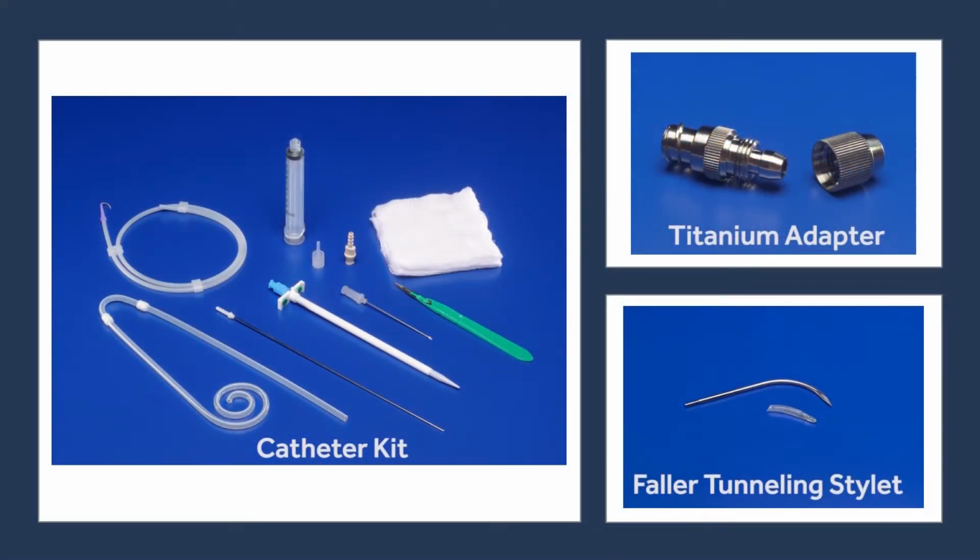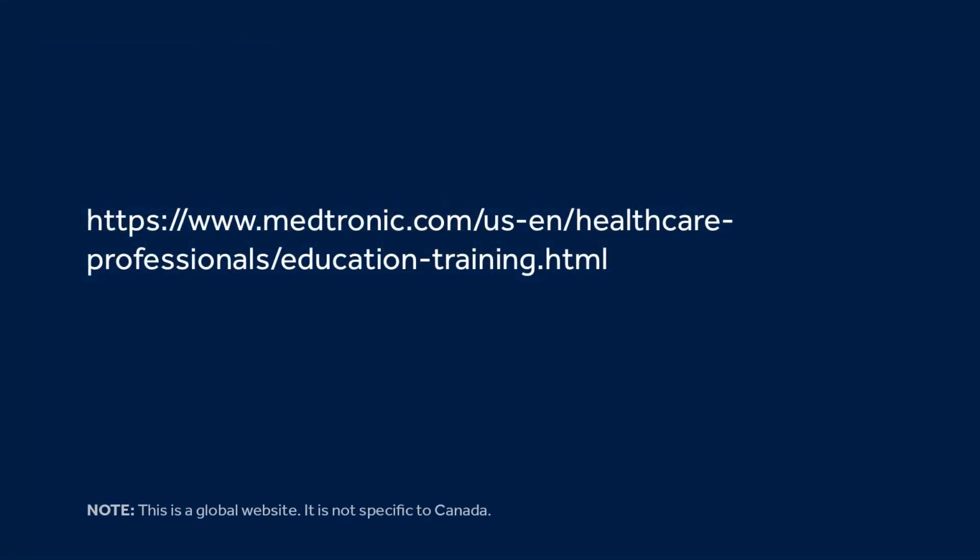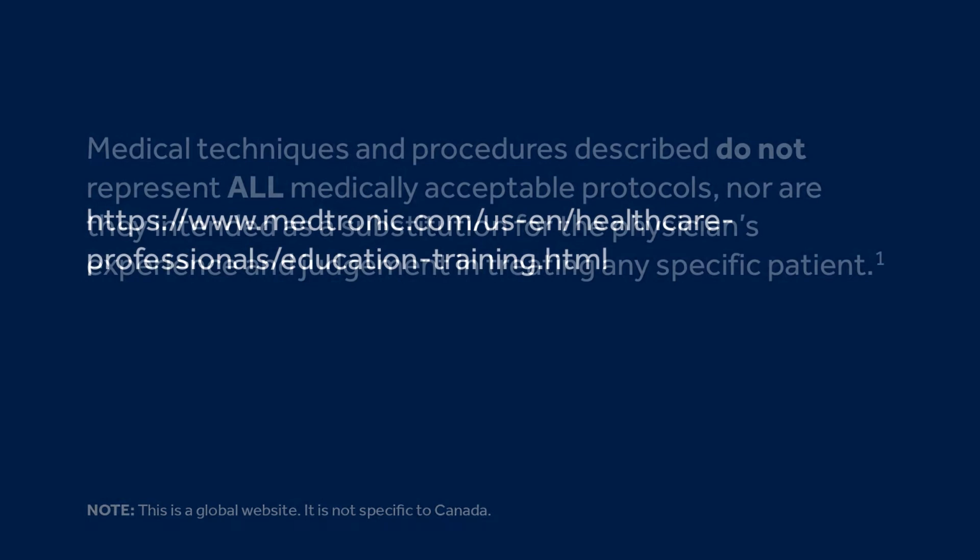Medtronic offers a wide variety of catheter configurations and also offers individual accessories and kits. Kits like the one shown are recommended for percutaneous catheter placement and offer a convenient and cost-efficient option. Additional educational resources for alternate insertion techniques are available through the Medtronic homepage using the Healthcare Professionals tab.